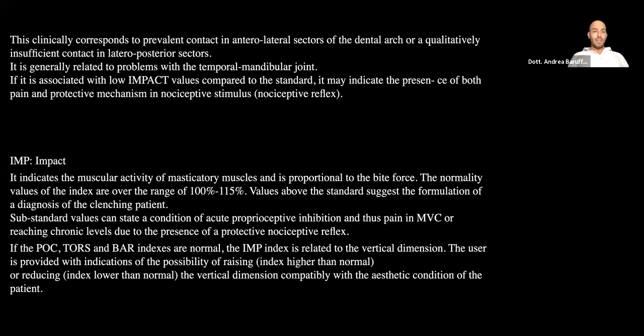And if the torsion is associated with low impact value compared to the standard, it may indicate the presence of both pain and protective mechanism in nociceptive stimulus, because the patient feels the pain due to the torsion and instinctively applies less force during the clenching.